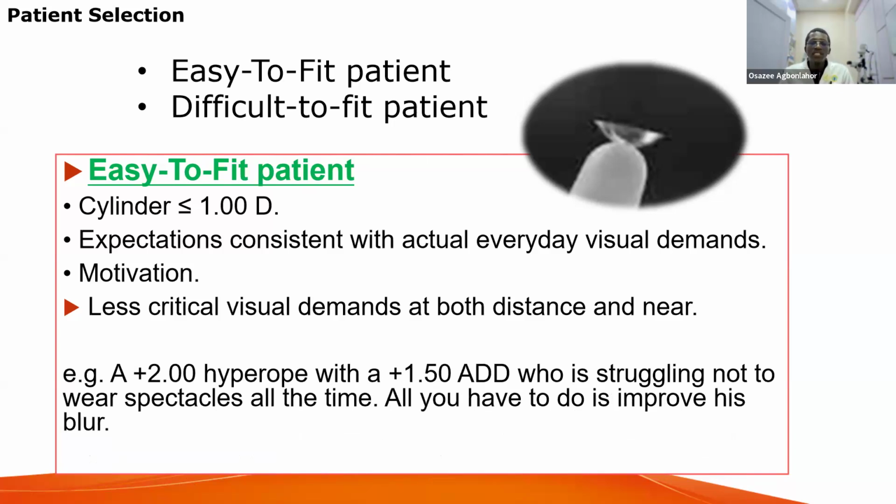And most times, patients with hyperopia at distance, particularly hyperopes, are very good candidates for contact lens fitting. For those of you that practice this, you see that it's usually easier with multifocal contact lenses compared to those that are emmetropes at distance and are also presbyopes.